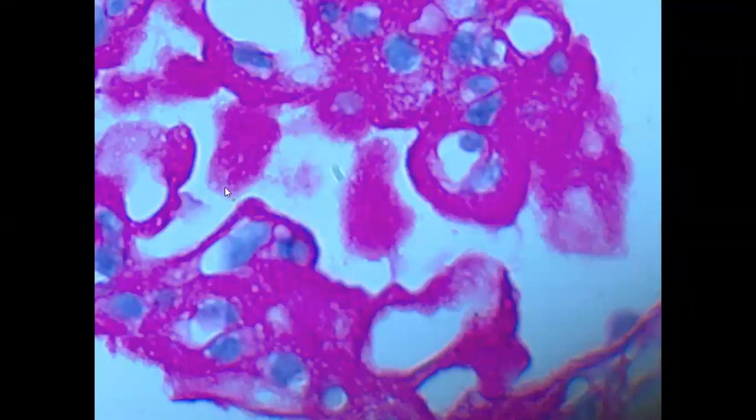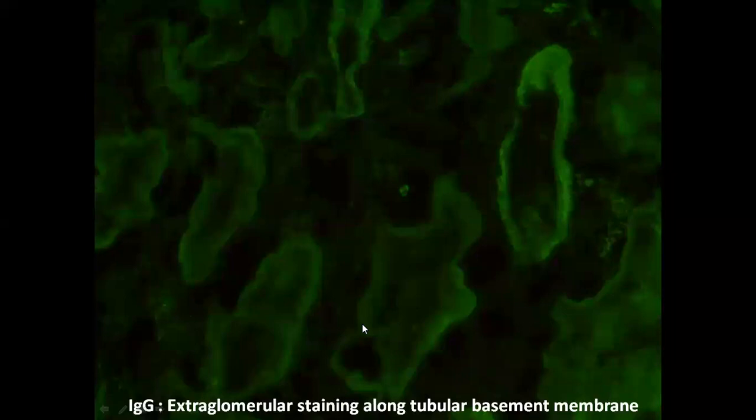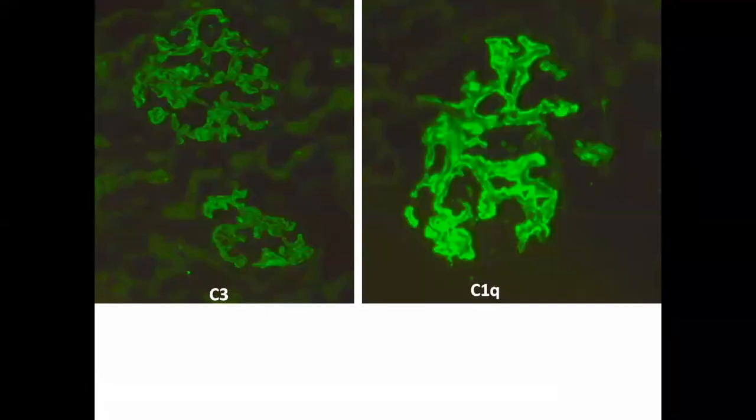The other thing is, when you do PAS, if you are able to demonstrate occasional capillary loops, just see this membrane and compare it with this. Whenever you find this kind of non-uniform thickened membrane with wire loop like deposits, and if on immunofluorescence you find IgG, a little bit of IgA, some IgM, and some minimal staining along the tubular basement membrane, these are the findings which suggest autoimmune pathology.